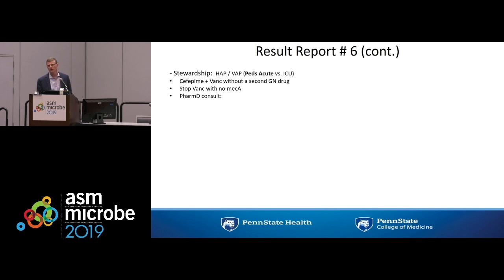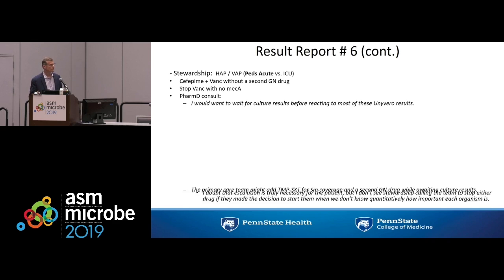So here's what the PharmD consult says on this, and I've just quoted him, and we spent some time talking about this. His first comment is that I'd want to wait for culture results before reacting to most of the Unyvero results. So in this particular case, let's say you see these results in the afternoon. From a stewardship perspective, they'd say, okay, got a lot of stuff going on here. We know that some of this could be just part of normal respiratory flora. I think we put a hold on this. We don't make any intervention. We wait until the next day, and we start to see if the culture begins to help us figure this out.